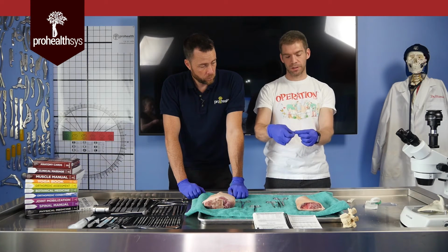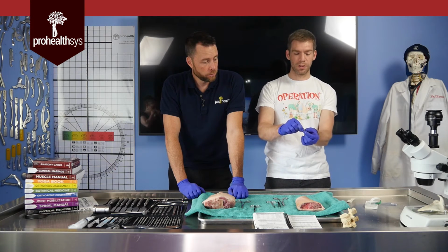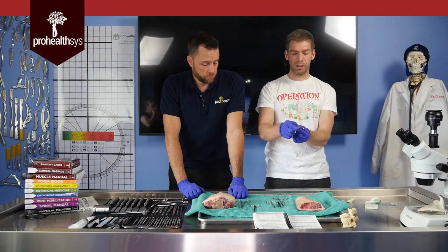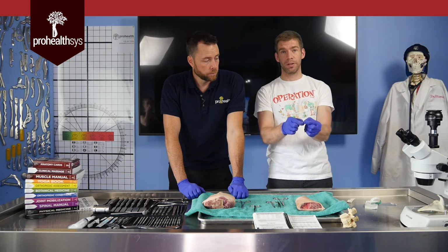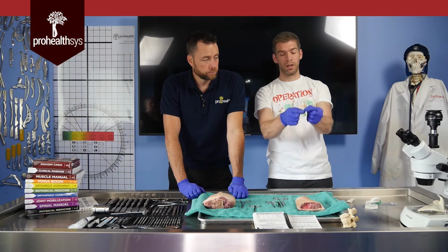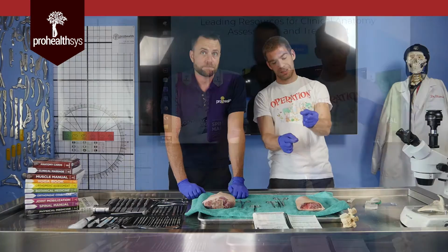So I'm going to take my other hand, because I like using my right hand to stretch it out. Again, never touching the tip. Where you have to grab this is at the junction of the metal and the string. Don't grab the metal. If you grab the metal, you're strong enough, you'll pull the suture material right off the needle. And I'm going to pull it straight.